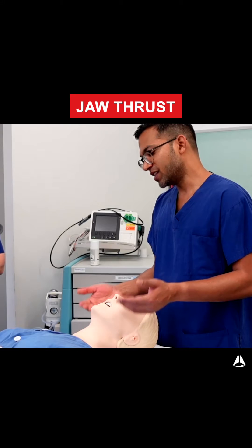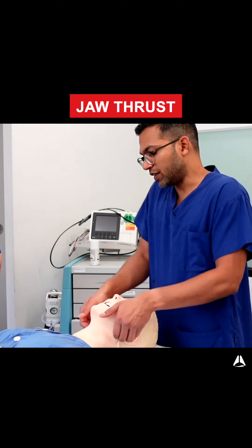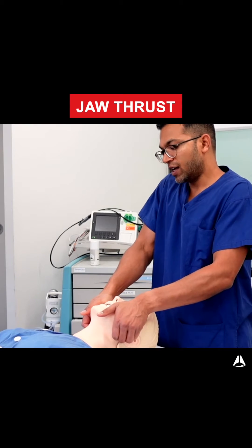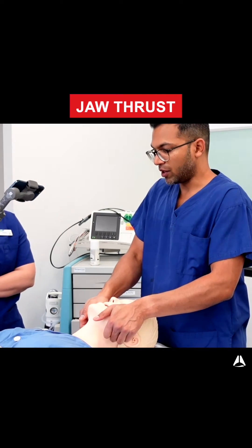Sometimes you need your strongest fingers to do this. Using the pointer finger and middle finger, and sometimes placing the palm on the cheeks, allows an even bigger jaw thrust. Especially in the most difficult patients, this is pretty optimal.